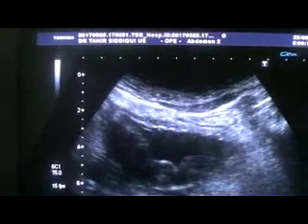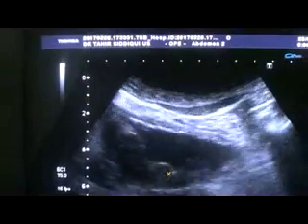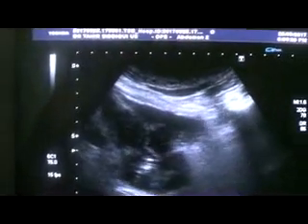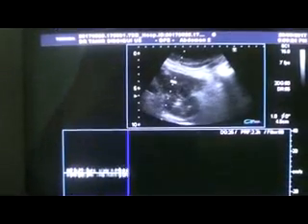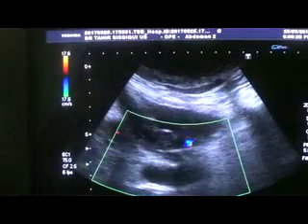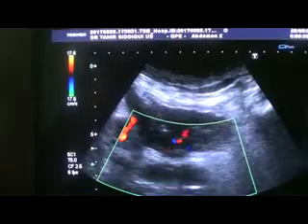Its thickness is normal, but see the posterior wall, which relates again to the prostate here, and it's blocking both UVJs, and there is vascularity seen throughout this.